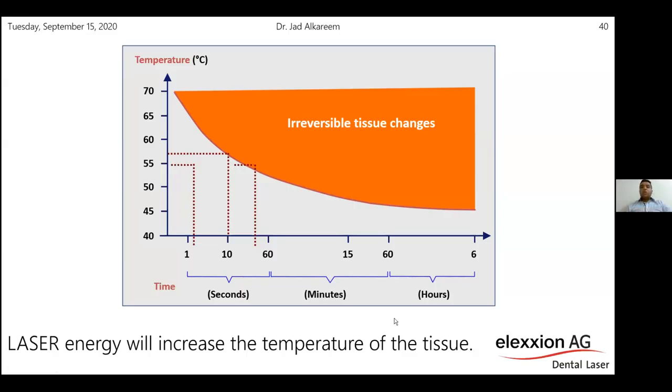So that's why when you use the laser, try not to use a very long application time. Try not to work very fast and not to work very slow. You have to be in an adequate time, which is enough for the application.